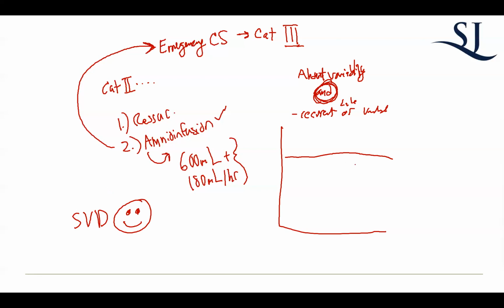For your simulations, you walk into a room and I'm going to give you your fetal heart rate tracing, which we'll actually have on a monitor that looks real. I'm not just going to draw it. Then you'll have a mannequin there, and there's a bunch of things that she can simulate. And then we're going to see what your management is.